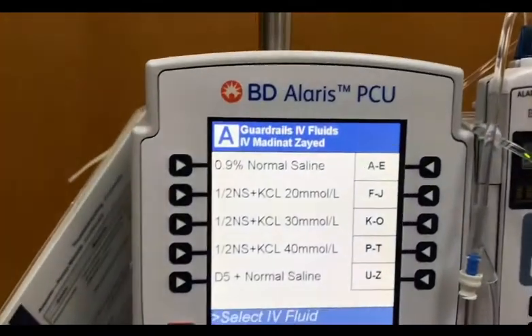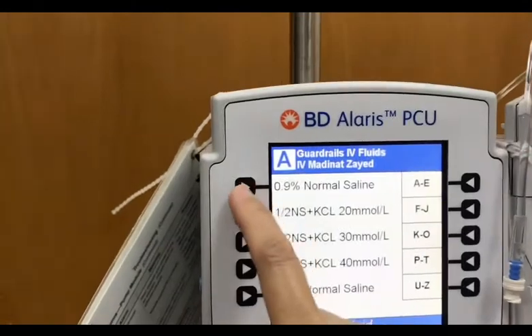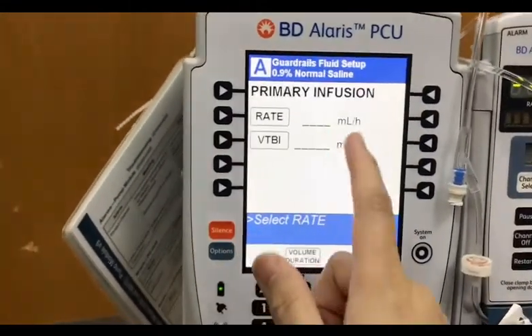Normal saline. They read this as normal saline, or normal saline if you're a Filipino. So just press the normal saline. Is this correct? Yes, I'm correct. And now what rate you want?